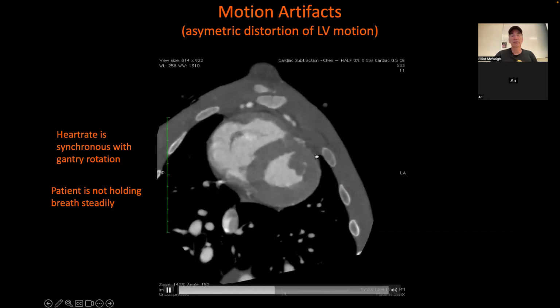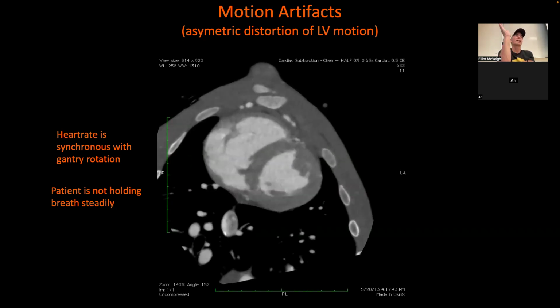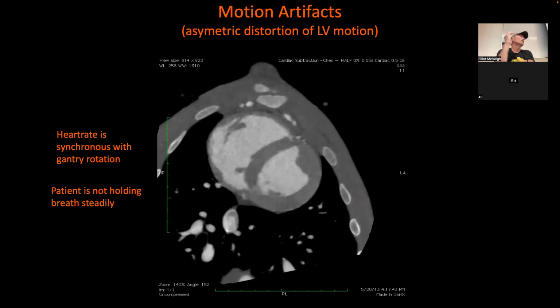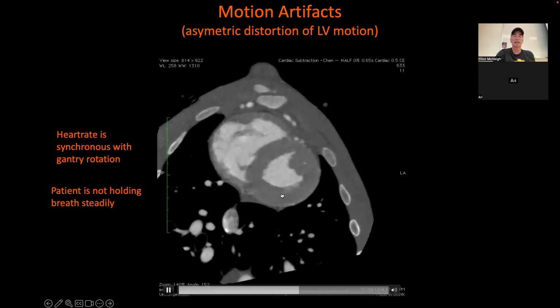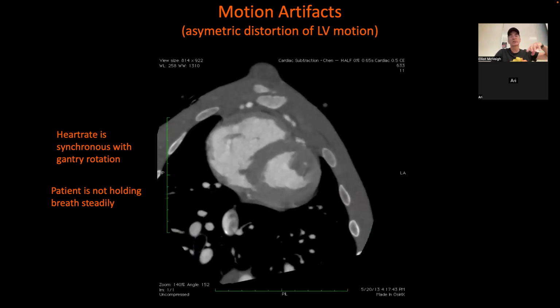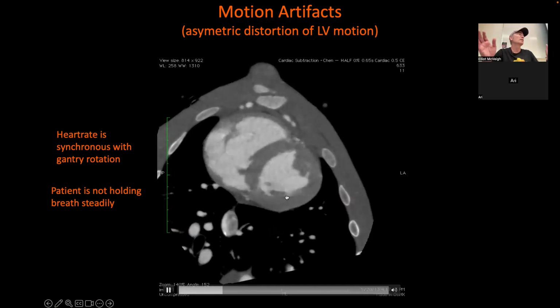The other thing you have to take into account is that if you don't do motion correction in CT and you're using a scanner that has a single detector and it's going around every quarter second, right? So it's 4 times a second it goes around. You're still undersampling the motion field for some of the phases of the heart. And you can see this classic artifact here in that the heart seems to take discrete steps. So you really have to go back and do motion correction frame by frame, which is absolutely possible because you can detect all these surfaces and do motion correction.